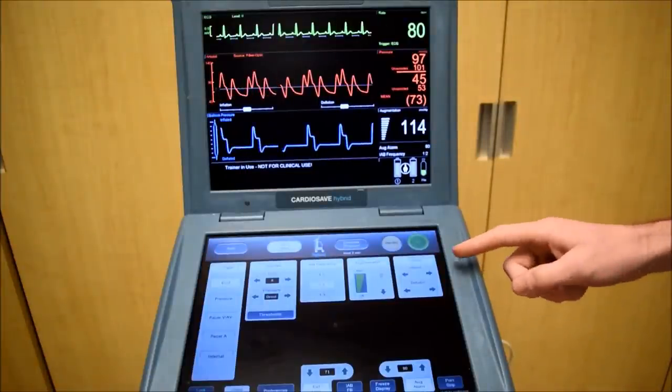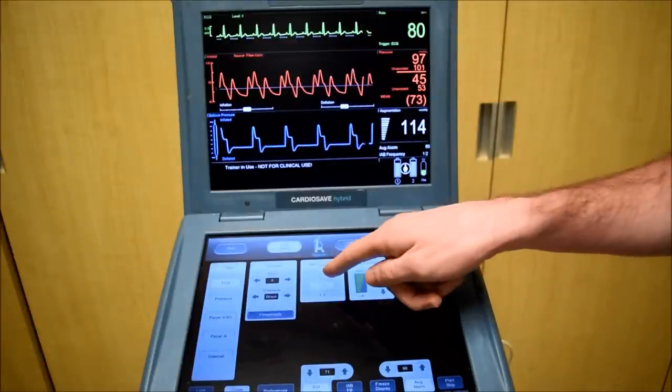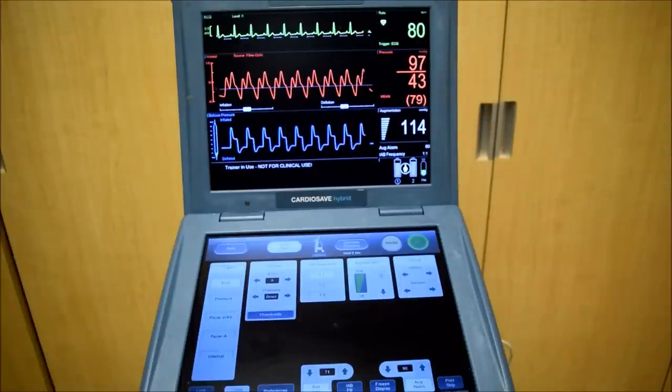Now that we've timed both inflation and deflation, I'm going to put the balloon back in 1 to 1. This will mean that each beat will be assisted.